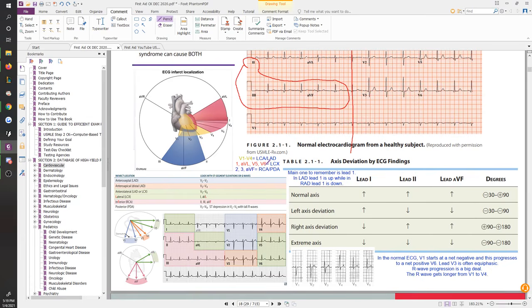Then V2 through V6 are all going to go on the left side, basically encircling and going under the left nipple. Right? So starting from in between the left nipple and the mediastinum, and then going under and around the left breast and the left nipple. 2, 3, those go on the legs, and you're going to have your AVL, left hand. So these are all the different places these leads are being placed.